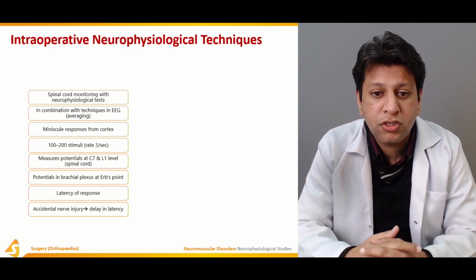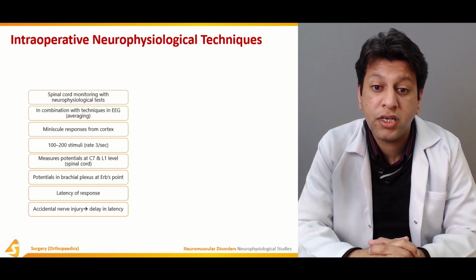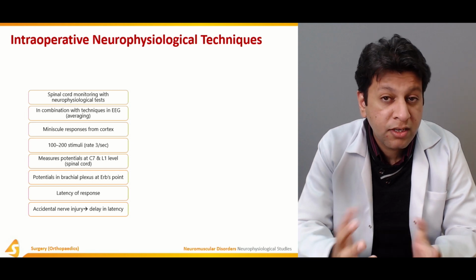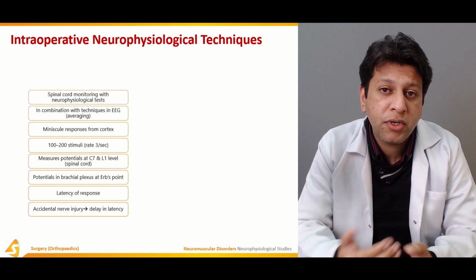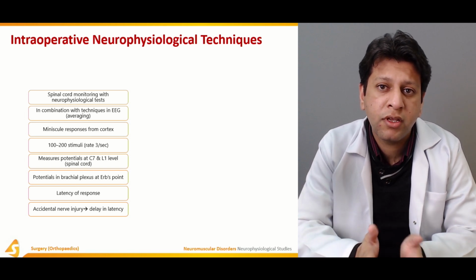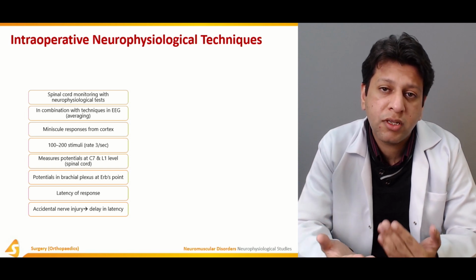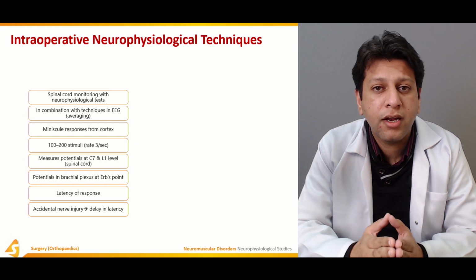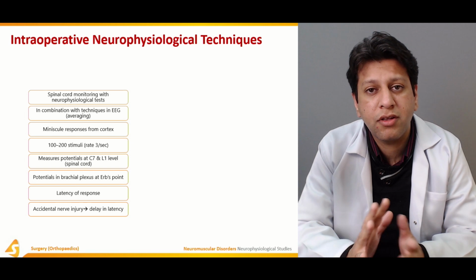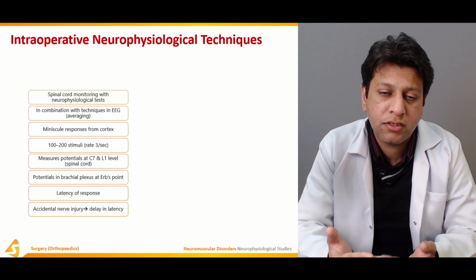Usually, these are loosely termed as intraoperative neurophysiological techniques. These include spinal cord monitoring with a neurophysiological test, called the evoked potential test, where the patient is under ketamine. Before surgery, the patient is told everything, what to do and what not to do, and when they will be asked to do this, for example, raise a leg or not. And in a certain phase of the surgery, when this patient is under the influence of ketamine, a command is given to do this kind of thing.